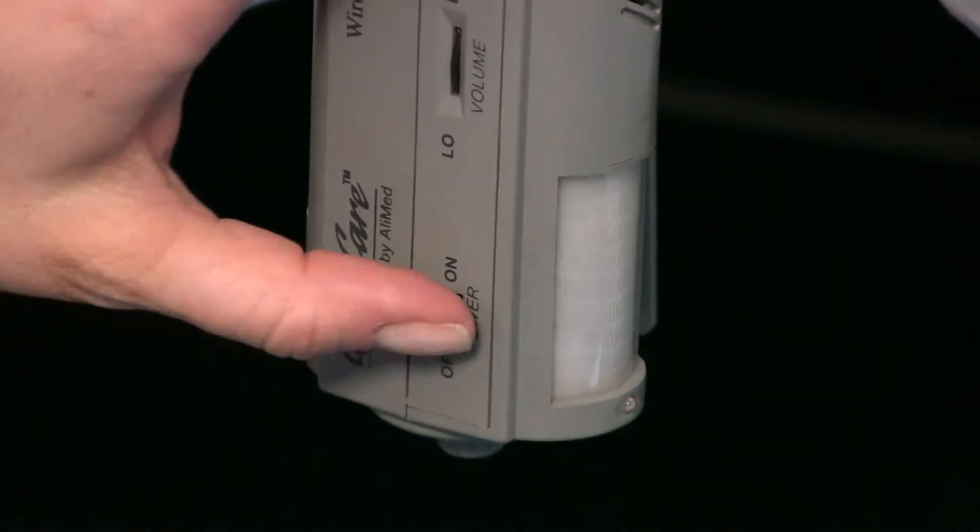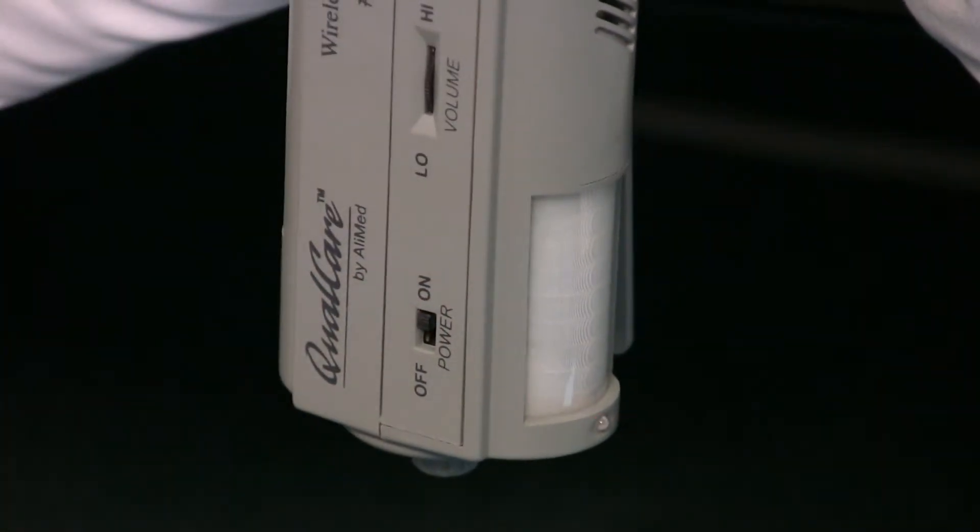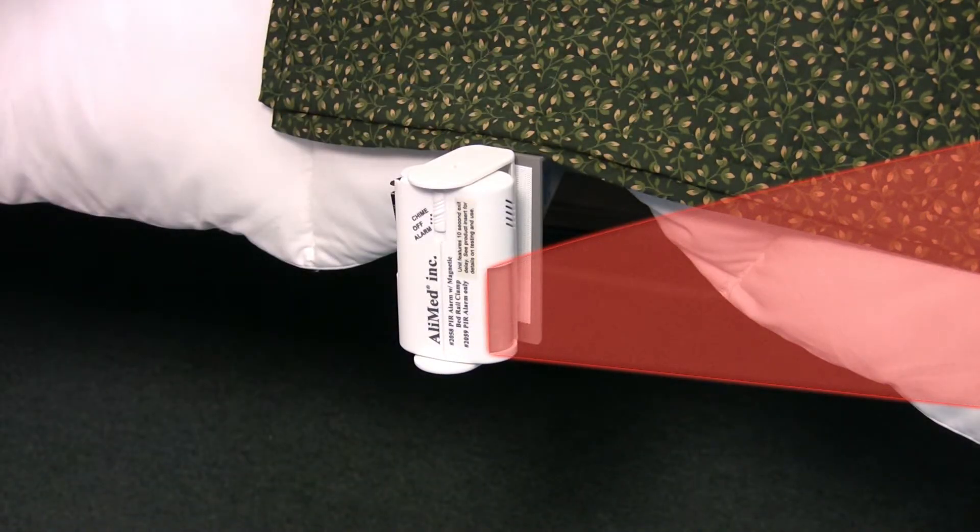First, switch the unit on and adjust the volume slider. The alarm then enters the 10 or 20 second delay mode. Wait for the alarm to beep, signifying it is ready, and then pass your hand through the sensing field — the alarm will sound. Now that your sensor unit is set up, tested, and ready to use, set up the remote receiver.